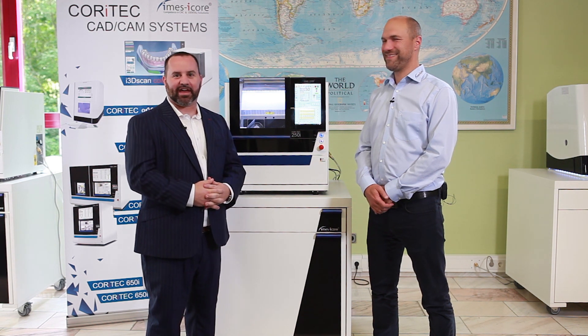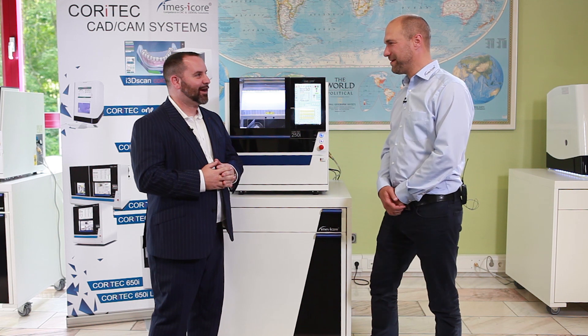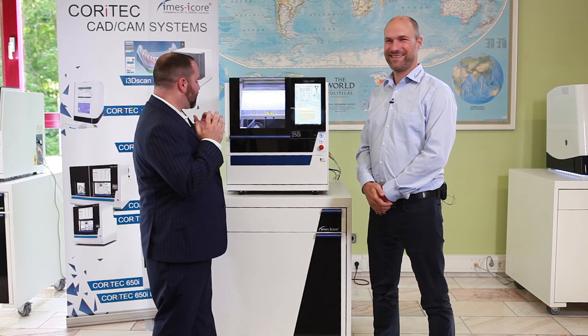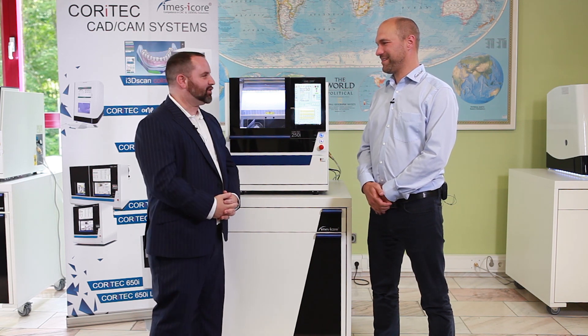Hello everybody, it's Scott Crane with Proto 3000. I'm up here in Germany at imes-icore with Michael. Hello. Good to see you again. I am here in front of the CORiTEC 250i milling unit.